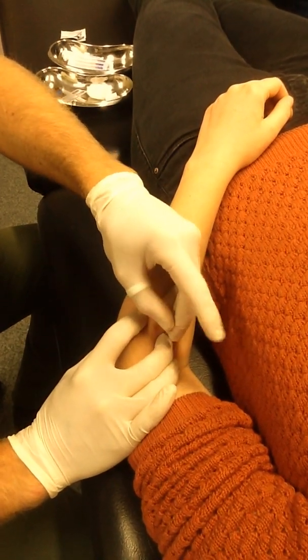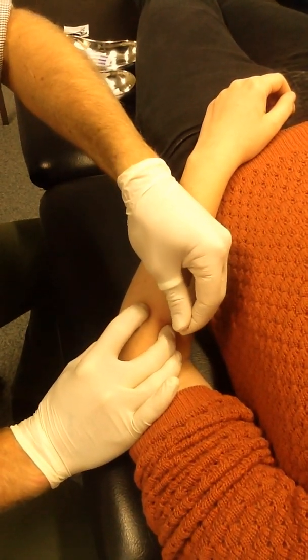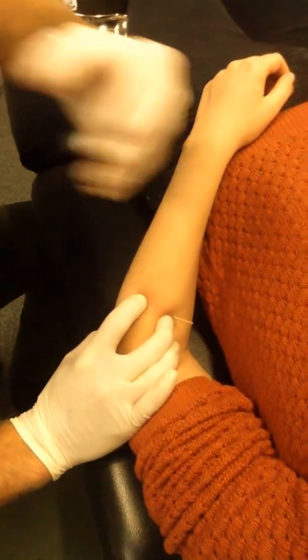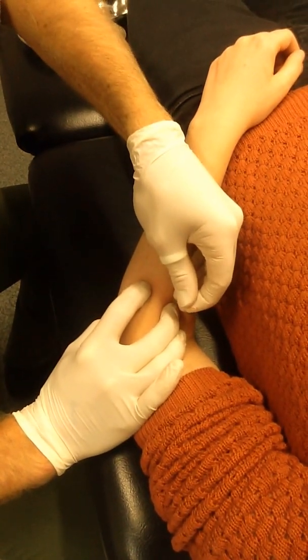So I tend to isolate them like that and drop straight in. Like what we were talking about before — almost like peeling an onion — you might find treating longus before you treat brevis means that it's easier to sort of move past it and then feel what's happening with brevis and treat that effectively as well.